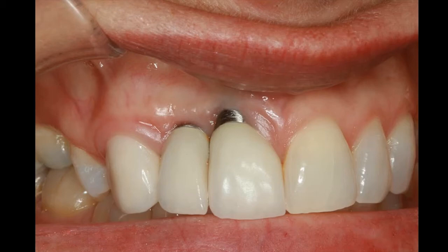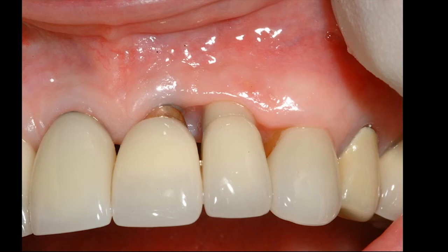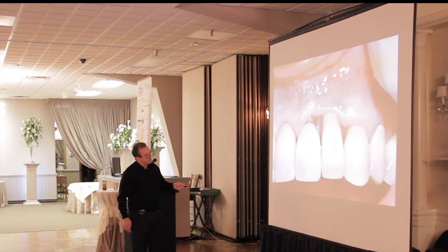Here's a case I did eight or nine years ago. The lady came in recently and doesn't like the way it looks. If you look here, the tissue is very thin. We can cover this up, but we're going to need a connective tissue graft in this area — in hindsight, we should have done that back then. This abutment may be a little over-contoured, which can cause tissue to rise up. Nowadays, we'd definitely use a zirconium abutment so we don't have that gray showing through.